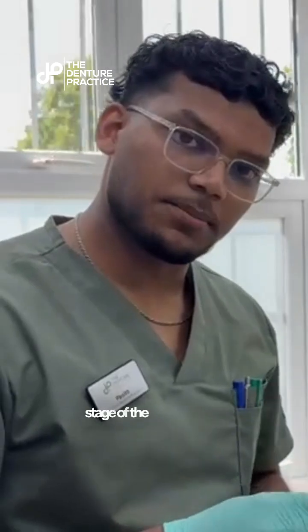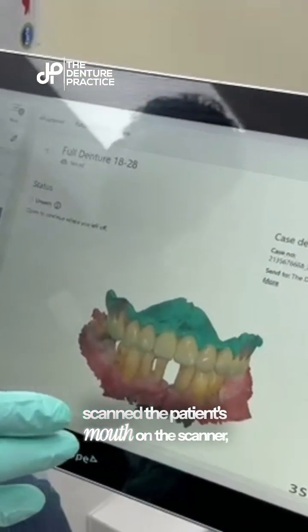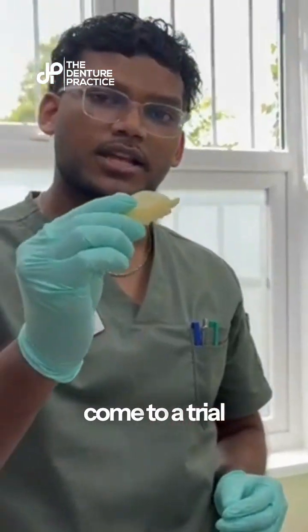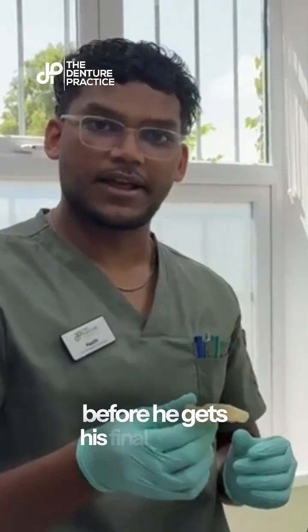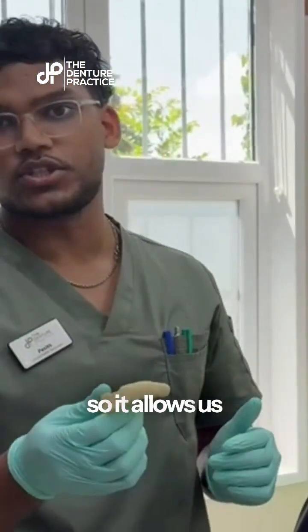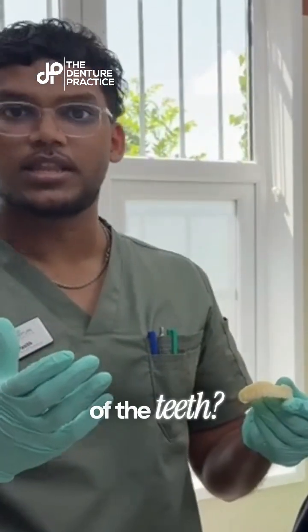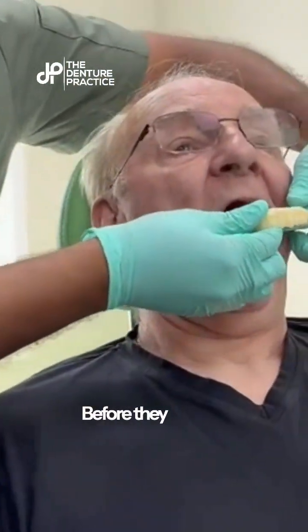At the second stage of the appointment, after we have scanned the patient's mouth, we have come to a trial denture. This is going to be tried in the patient's mouth before he gets his final denture. It allows us to find out what patients like — does the patient like the shape of the teeth, the color of the teeth, does he like the feel of the teeth before he actually gets the denture.